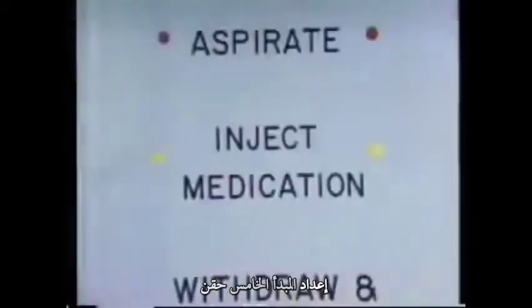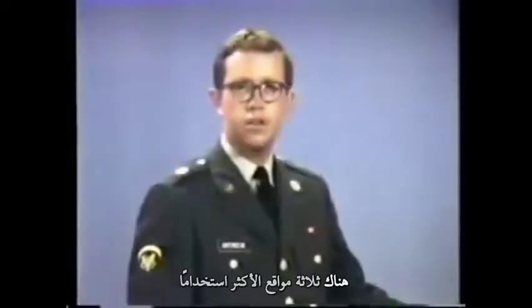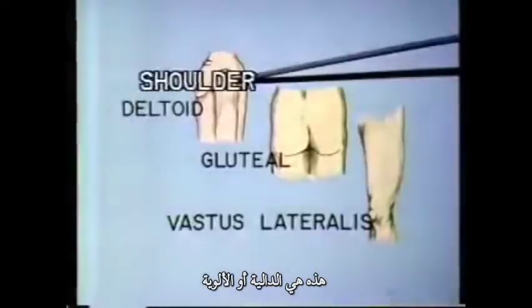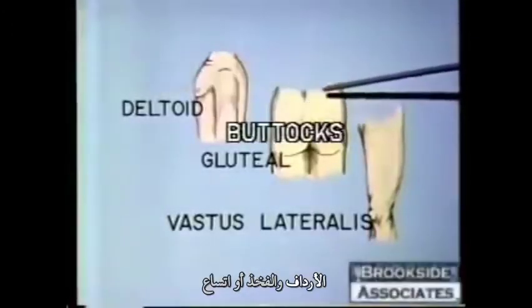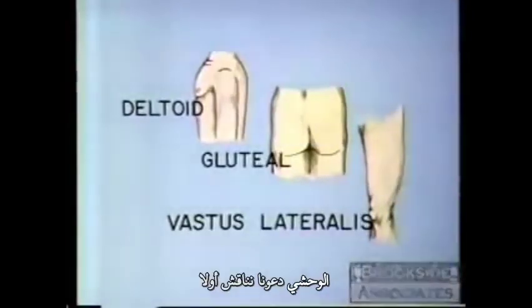The fifth principle: inject the medication. And finally, withdraw the needle and syringe and massage the site. There are 3 sites most commonly used. These are the deltoid, the gluteal or buttocks, and the thigh or vastus lateralis.